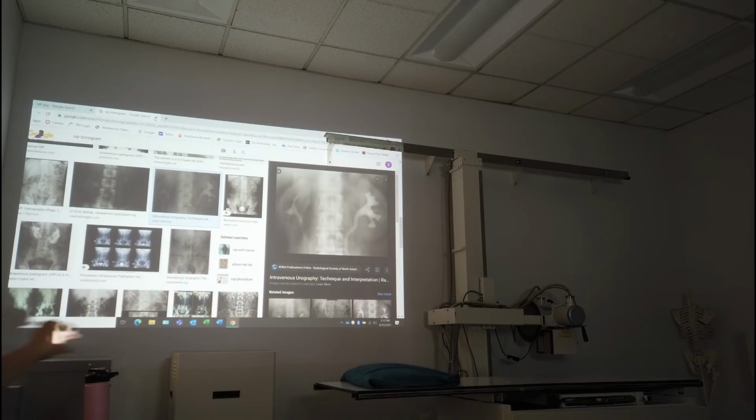You're trying to get exactly in the middle. If this is the kidney, you want to go boom, boom, boom. You want the middle parts. Usually the doctor will figure that out. He or she will look at that and say, oh yeah, that's a pretty good slice right through the middle of the kidney. I can tell you're in the middle of the kidney. So if this is 8 centimeters, give me like a 7, 8, and a 9 or something. That's what they'll do.